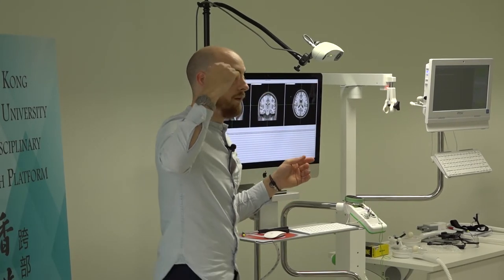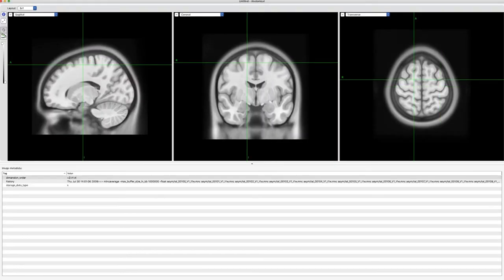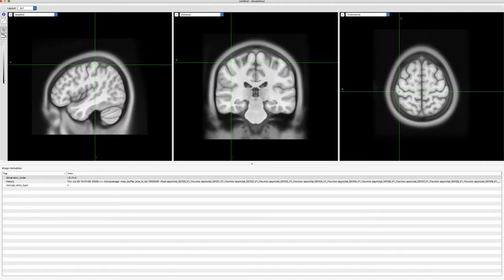So you can plot your targets using the MRI data of the MNI head project, which is already set, instead of having your own MRI data. But obviously for accuracy, you would rather have your own MRI data and then be plotting landmarks on there. What format is it in, do you know? Okay.